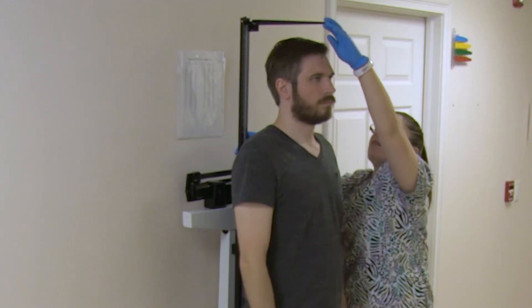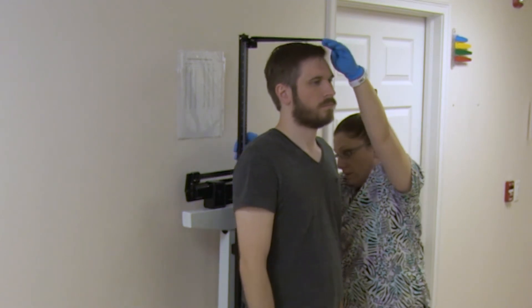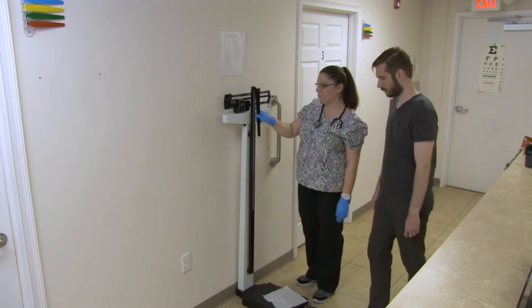The patient may stand on the scale facing away from the wall, with the measuring bar behind them. Lower the measuring bar until the arm is resting firmly on top of the patient's head.